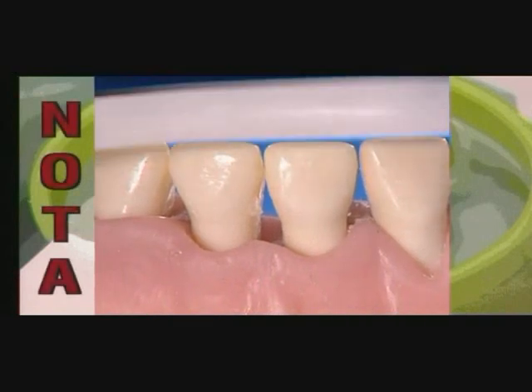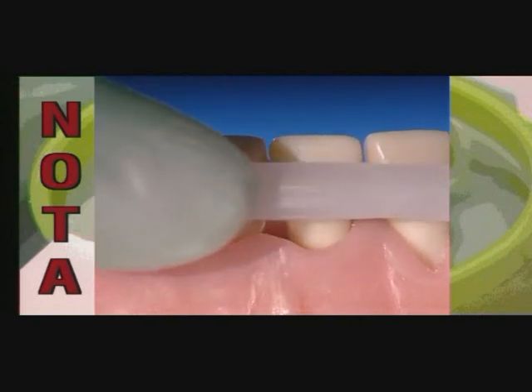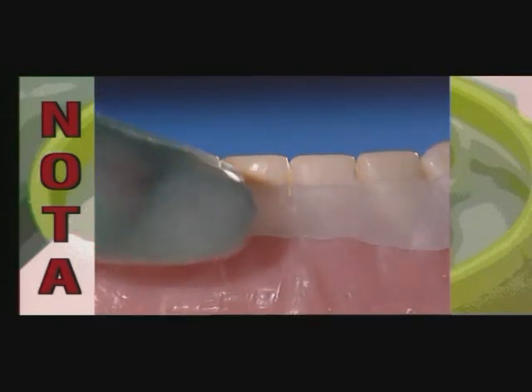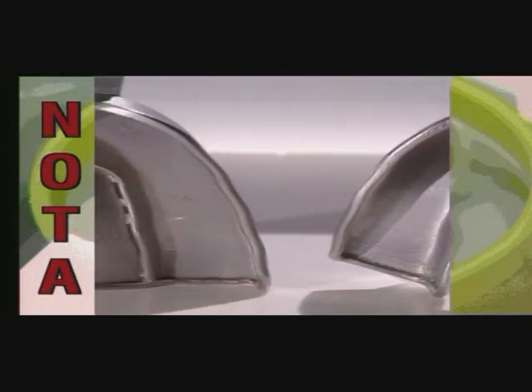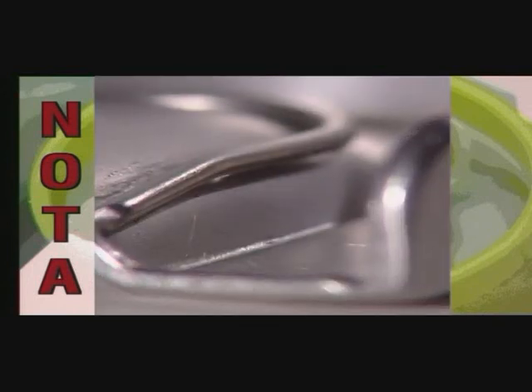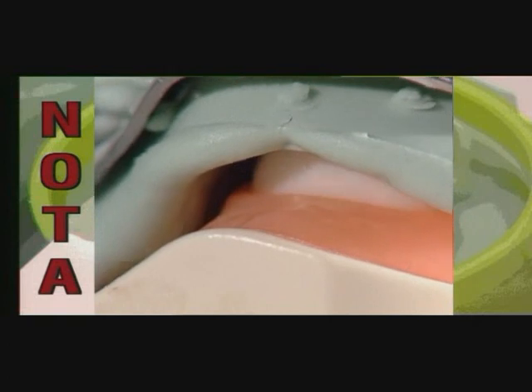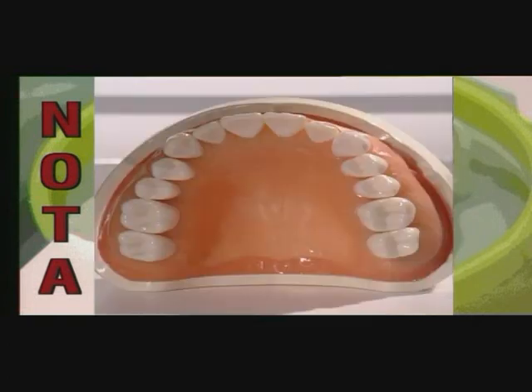A tip: vertical sites, greatly expanded approximal spaces or pontics must be blocked out with wax to prevent severe deformation or the alginate tearing off when the impression is removed. Only use stable, connection-safe and unperforated metal trays with retention ridges, for example, rimlock trays. Because of alginate's low tearing strength, perforations of the tray or bonded-in retention strips are not sufficient.